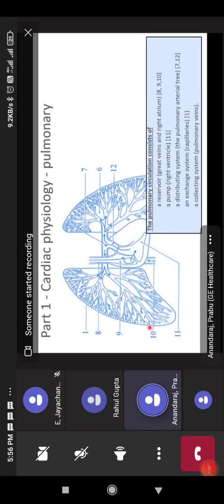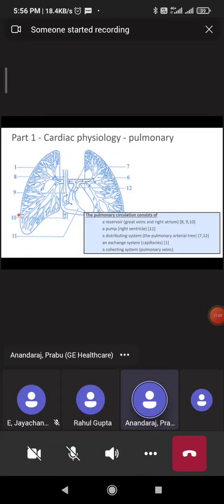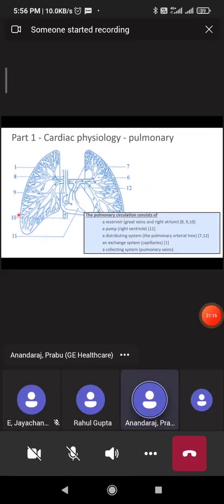And it takes the VO2 and VCO2 data plus the SaO2 and SvO2, and it calculates the concentration of the CaO2 and CvO2 data. It computes, and from that we are getting the cardiac output. So let us note that cardiac output, what we see in this thing.